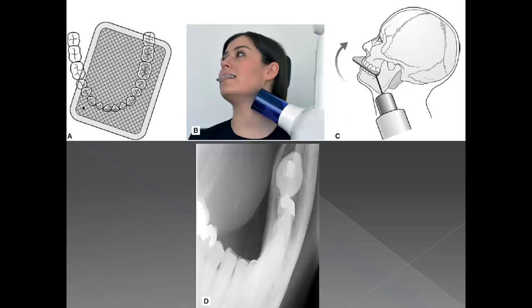All right, coming to the last occlusal X-ray, this is the lower oblique occlusal. This X-ray is basically done if you want to evaluate any sialoliths in the submandibular gland, especially if they are lying posterior or near the hilum of the gland. So this is a useful X-ray in that regard.